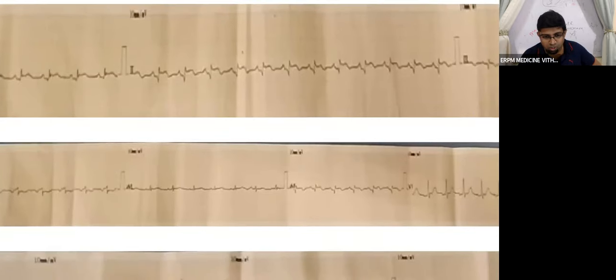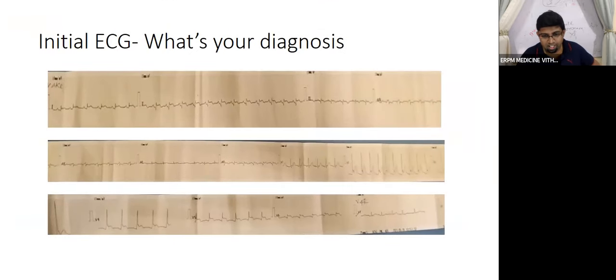Anybody wants to tell the diagnosis? Anterolateral STEMI. Anterolateral STEMI or anything else? Inferolateral. Inferior STEMI. Okay, somebody said a good answer. Inferior STEMI. Anybody else want to add anything?